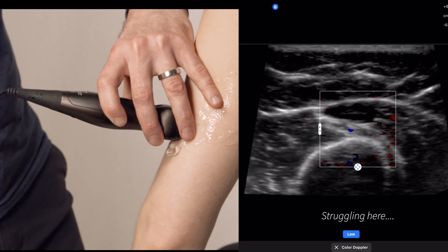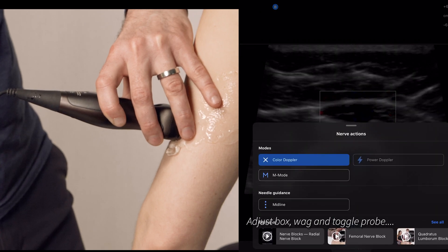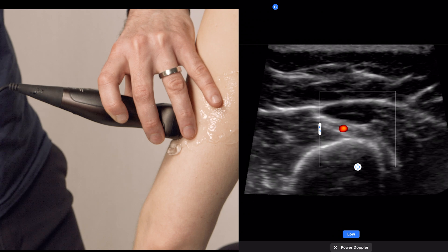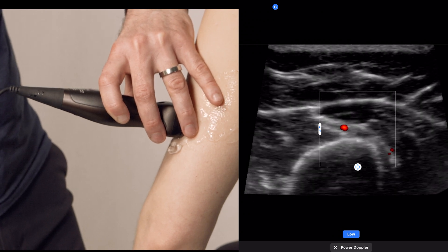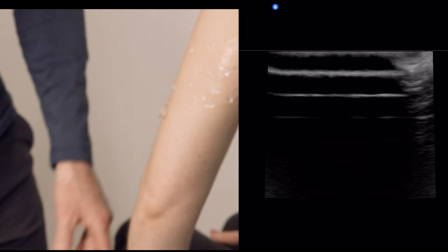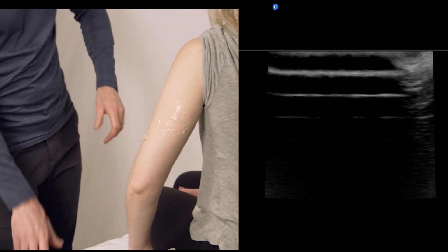You can see I'm smushing this. I'm going to start over again and do another pass.